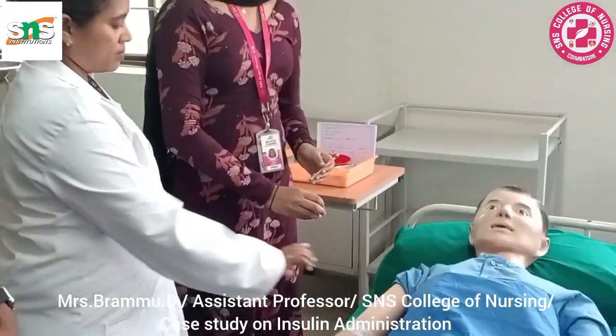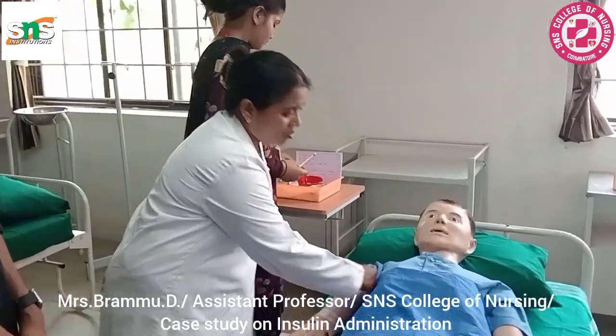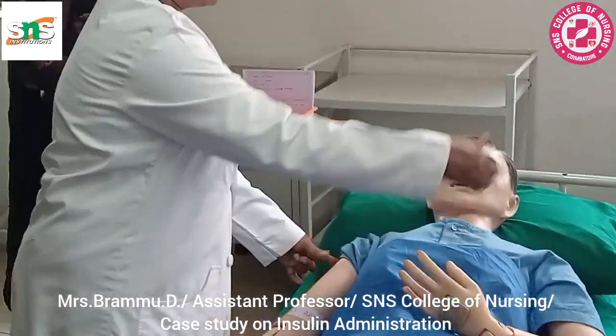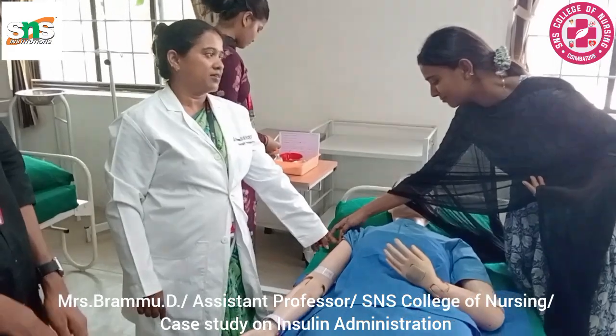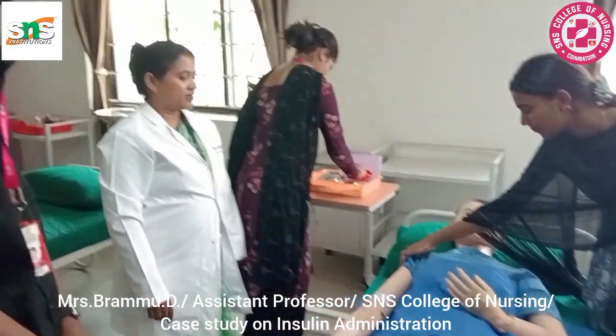After administering the insulin medication, we should not rub, but we have to ask the patient to hold with the other arm. He can hold it over here, or the attender can hold it for 1 second, or we ourselves can hold it for 1 second. Thank you. Why can we not rub like other injections?